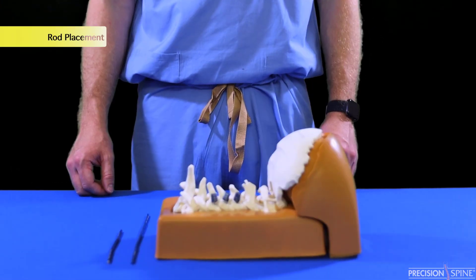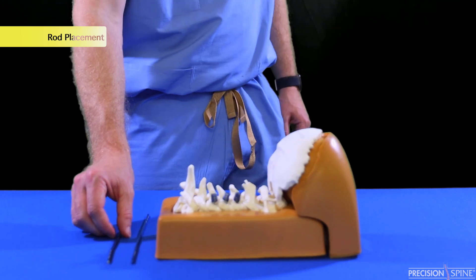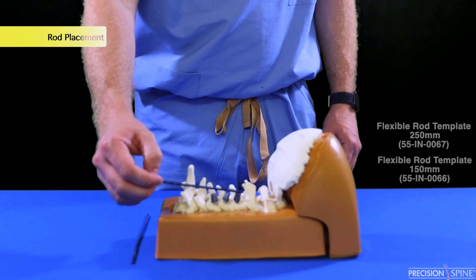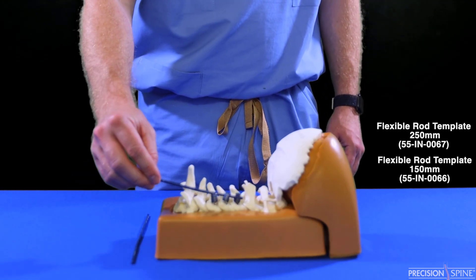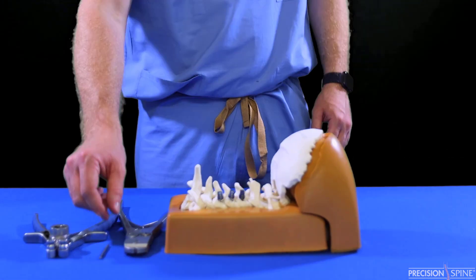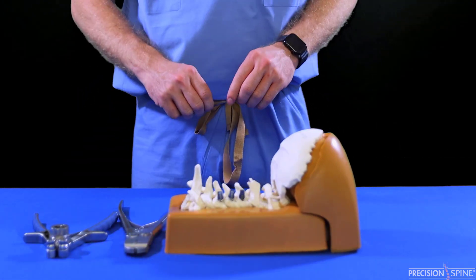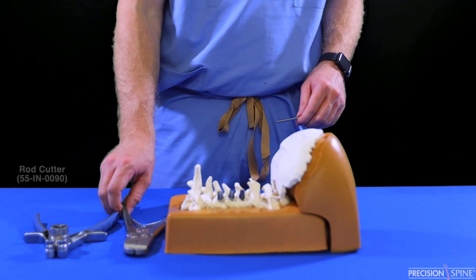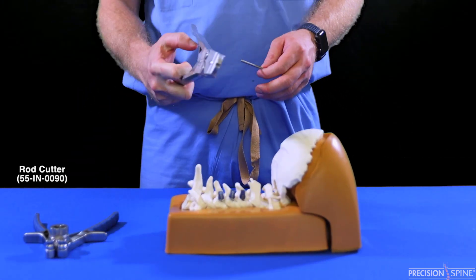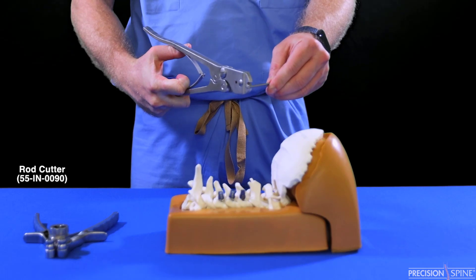Step 2: Rod placement. First, determine rod length with the rod template. Next, select the proper rod size. If the rod needs to be cut, utilize the rod cutter.